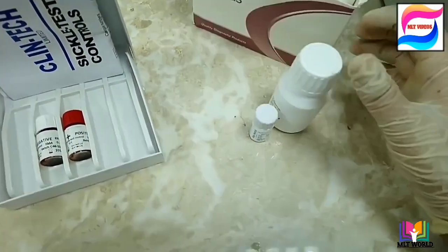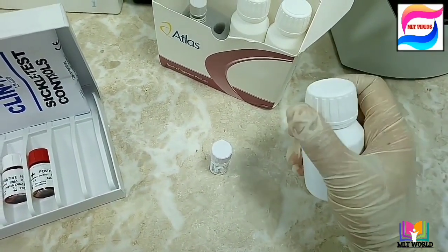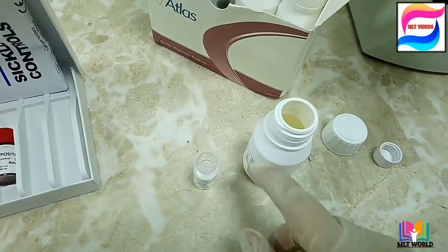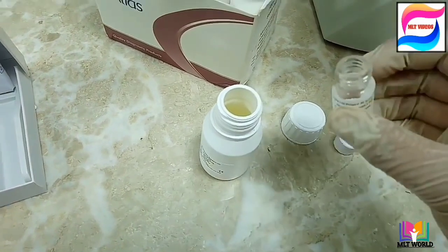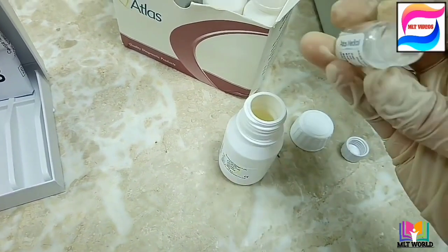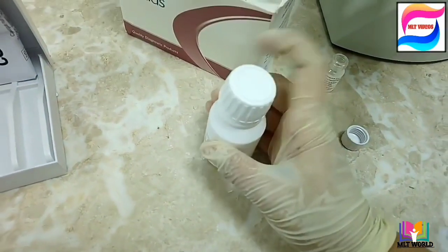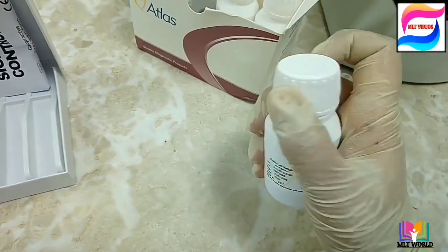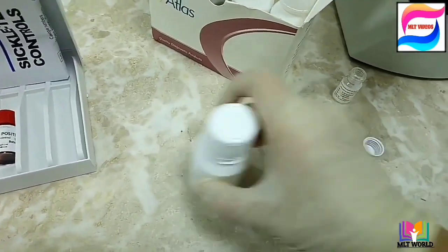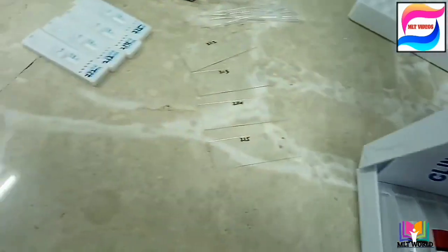First we will prepare the working reagent. Open Reagent A, which is in liquid form. Reagent B is in powder form — carefully pour it into Reagent A so that no powder is spread outside; all of it should go inside the bottle. Close the bottle properly and mix the reagent in a figure-of-eight motion, then keep the reagent for at least five to ten minutes so it becomes ready.